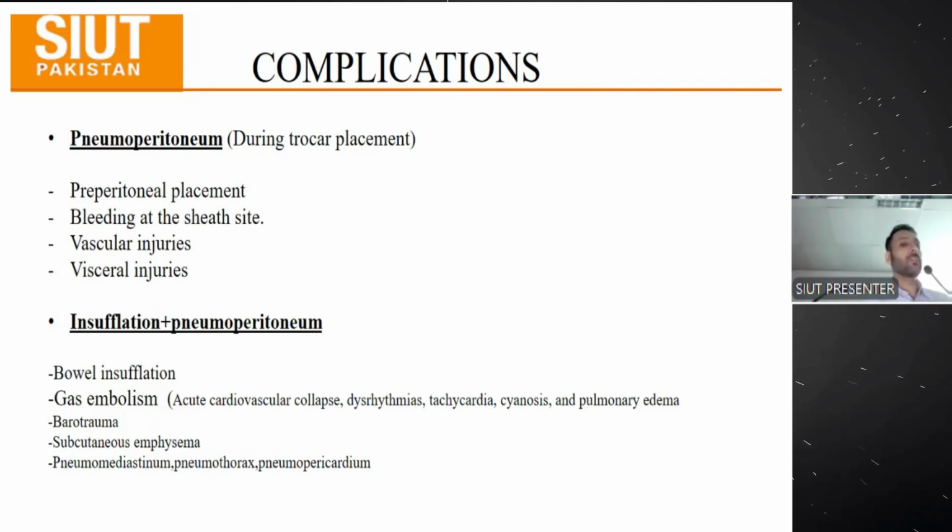And during insufflation, barotrauma can also happen. There are certain patients who have blebs in their lungs, and because of the high pressure, these blebs can burst. Subcutaneous emphysema, pneumomediastinum, pneumothorax, and pneumopericardium.